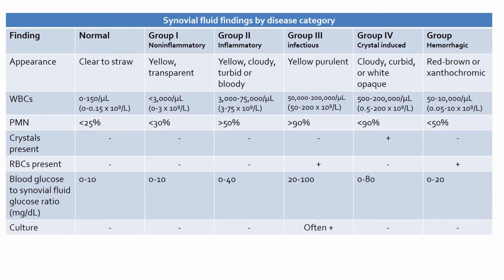had it placed in. These metal and plastic fragments can cause a discoloration of the fluid, including colors like blue and gray, and that would be usually only found in a patient who does have a prosthetic.